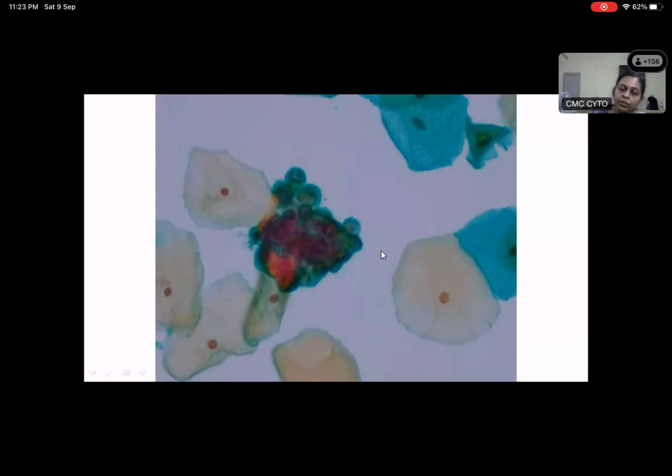Actually, when you look at endocervical or endometrial cells, often you'll have to use the fine adjustment to see the chromatin clearly, because they are very crowded and overlapped, and you need to see through to see the nuclei. So you will have to use a lot of your fine adjustment in real life. Here again it's not dark, it's still light colored chromatin. That much you can make out in this cluster, isn't it? It's not very dark, but it's crowded.